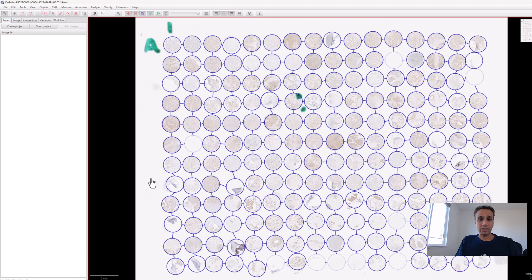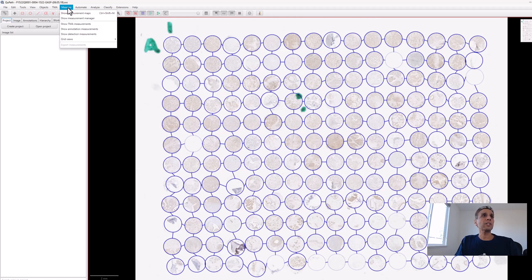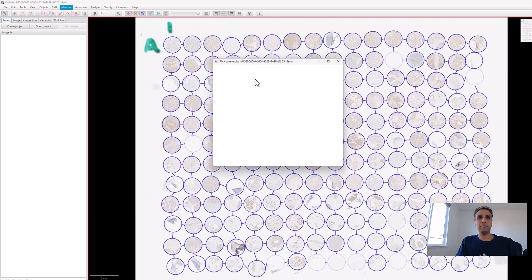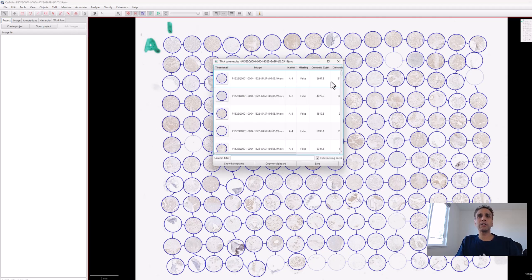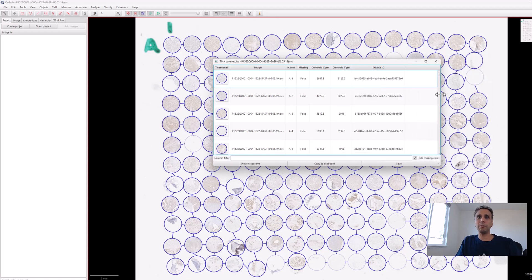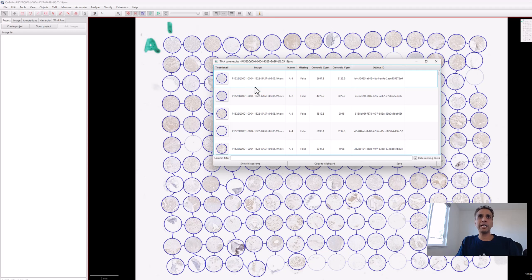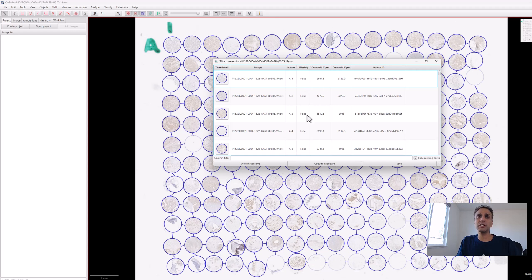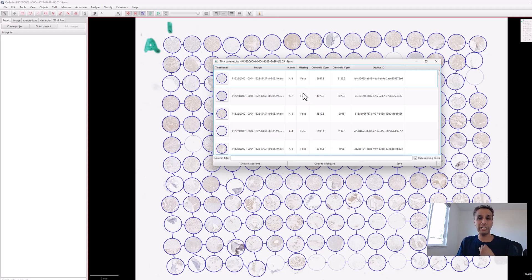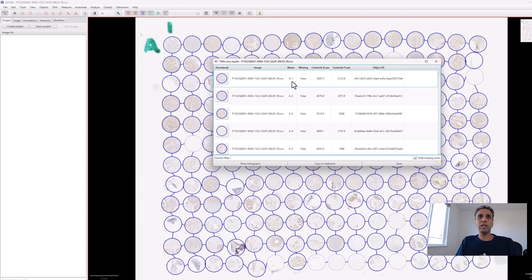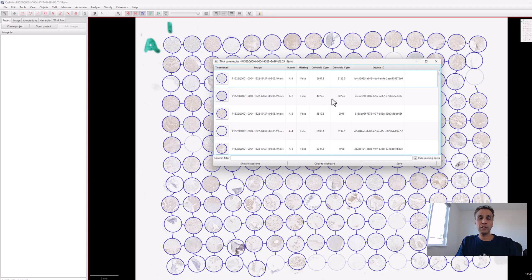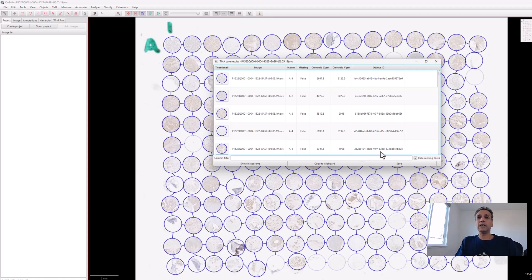Let's go to Measure and Show TMA Measurements. It stores the thumbnail image, the name, and whether it's missing or not. The useful information we need is the name because I want to save these cores as A1.png, A2.png, and so on, and the centroid X and Y. We know where the centroid is and can extract the cores.